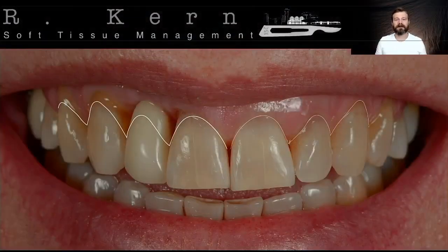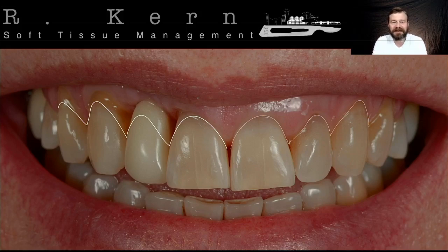Let's discuss what matters, that is this clinical case. You see this high smile line here, and we have some problems. Of course, this was an implant. This patient received this implant not longer than 1 year ago, after a huge bone reconstruction, done by a very nice friend of mine, with a very good handling of the bone situation.